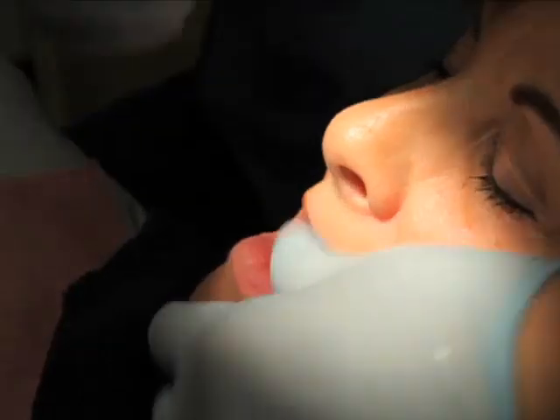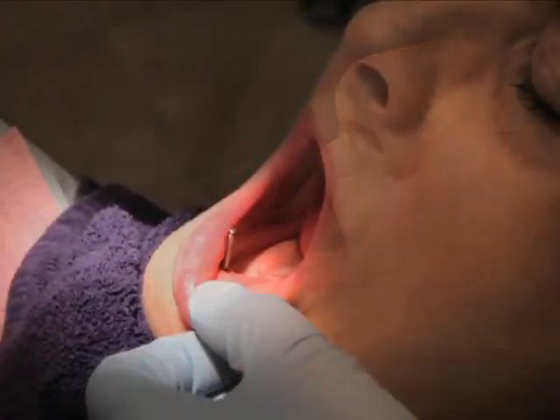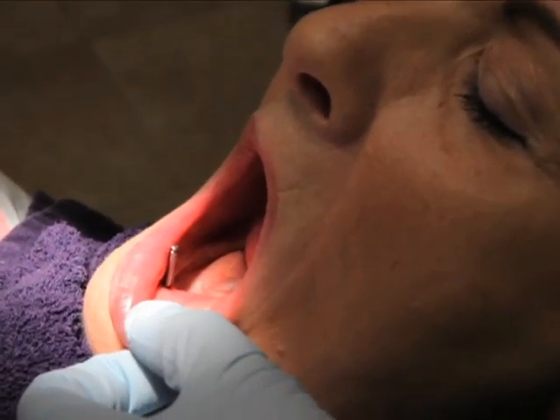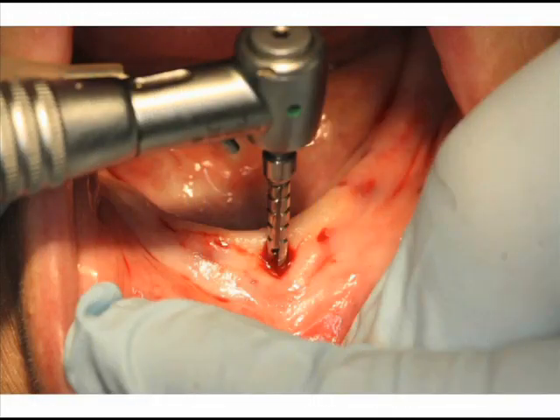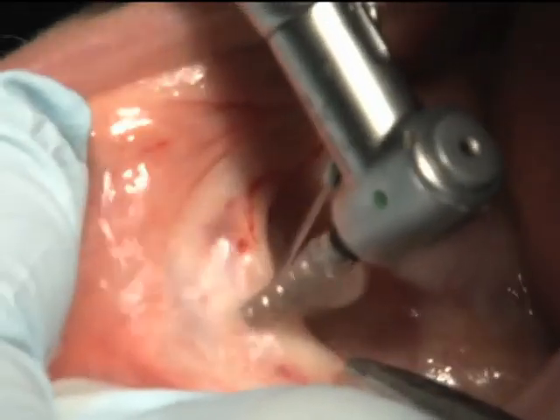The directional openings were used to correctly angle the drills to the predetermined depths, and that was 14 millimeters for the number 23 and 25 implant areas, and 12 millimeters for the 22 and 27 implant areas. Figure 20 demonstrates the use of a digital radiograph, which was taken to ensure proper depth. When we know that we have proper depth in determination of bone density and the height of the tissue, a 2.4 millimeter drill is then used to the predetermined depth to create the osteotomy site for the final 3 millimeter mini implant.